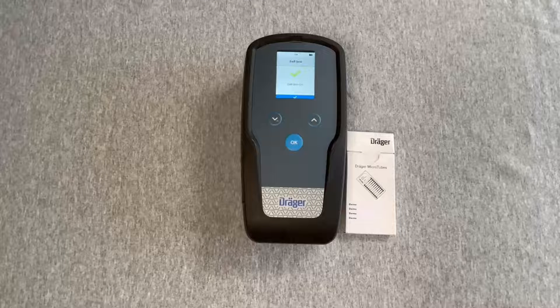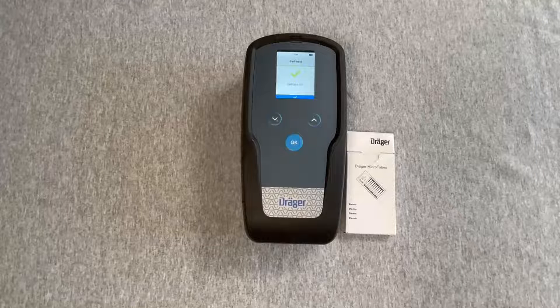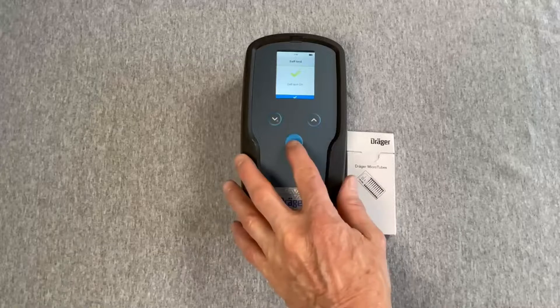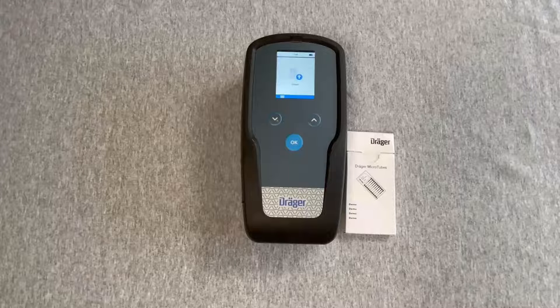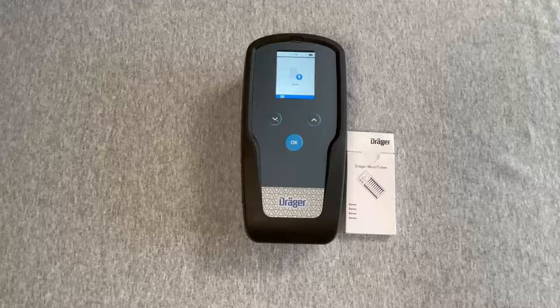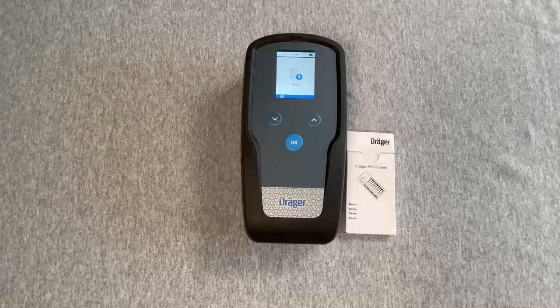Each time the white check mark appears in the blue bar, the device is waiting for the operator to acknowledge by pressing OK. Press OK to advance to the option to insert a microtube, or enter the menu using the three horizontal bars. Note: when the display backlight powers down, press any button to illuminate and enable use of the buttons.